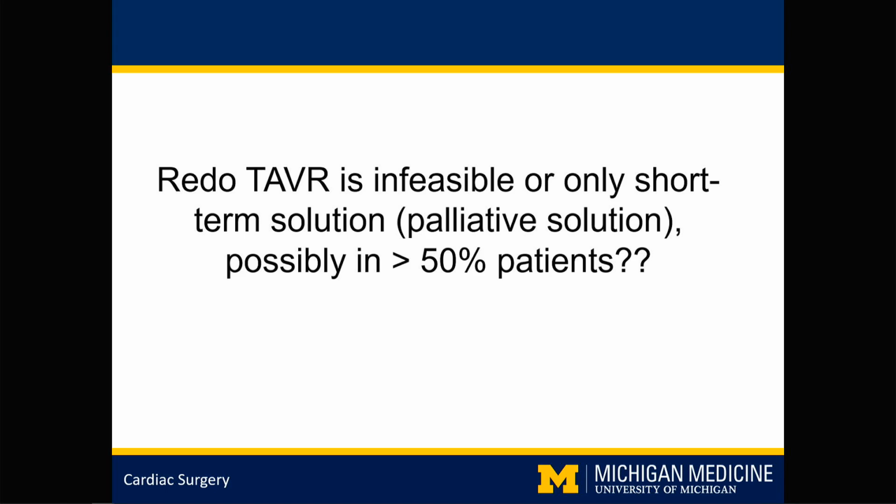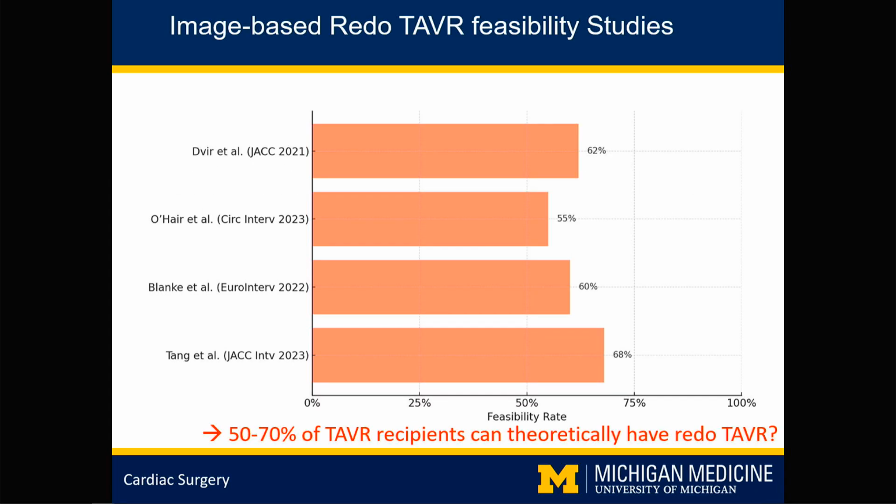So this is my suspicion: redo TAVR is infeasible, or only a short-term, palliative solution, possibly in more than 50% of patients. There are image-based redo TAVR feasibility studies, and those studies are saying that 50 to 70% of TAVR recipients can have redo TAVRs.